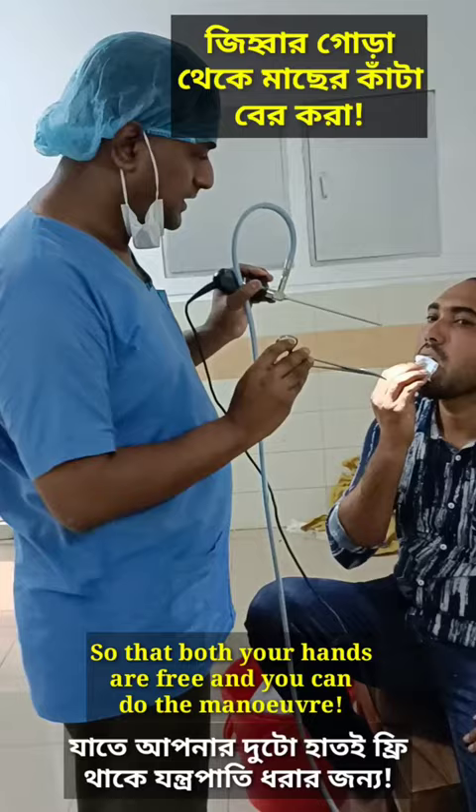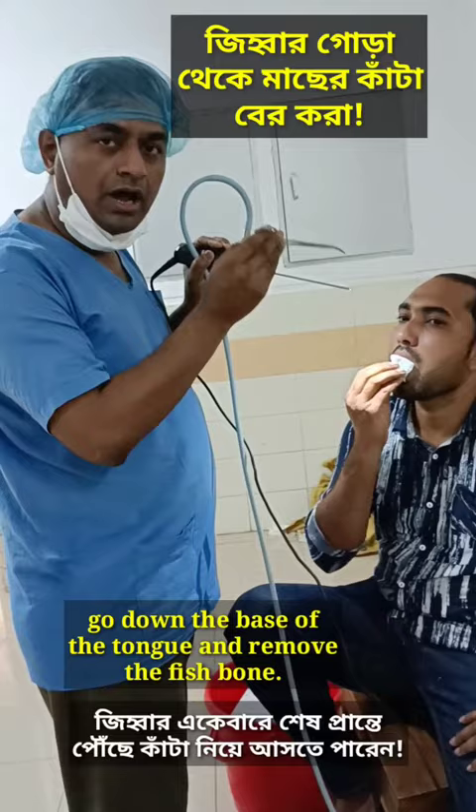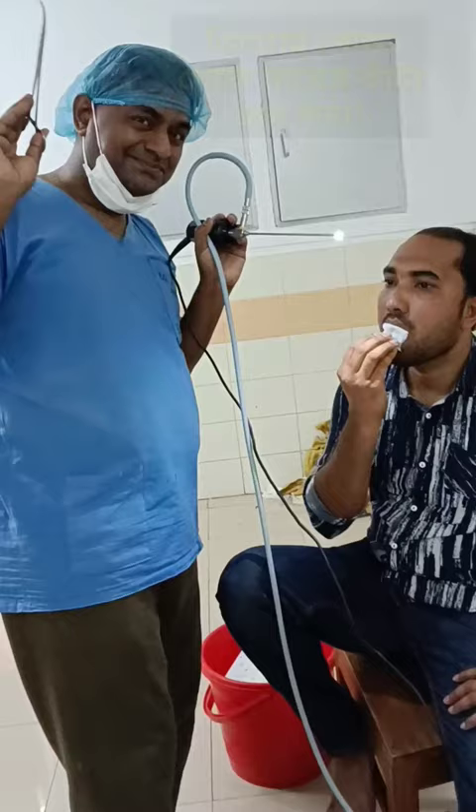If you just put your left hand holding the 70 degree scope, and you go with this curved artery forcep — a simple curved artery forcep — so that you can go down to the base of the tongue and then take care of the fish bone.